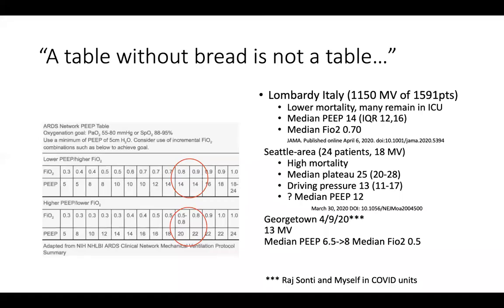And I'll show you a table that we typically use for ARDS, or one of these two separate tables: a lower PEEP strategy compared to the FiO2, and one that's a little bit more aggressive in ramping up the PEEP so that PEEP gets up to significant numbers, even with modest increases in FiO2. That higher PEEP table is often used for patients with more severe ARDS, determined by PF ratios below 150.